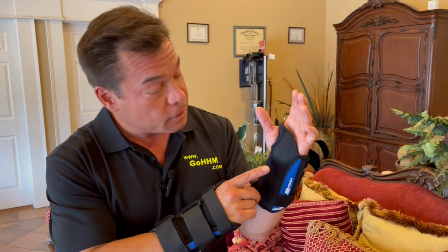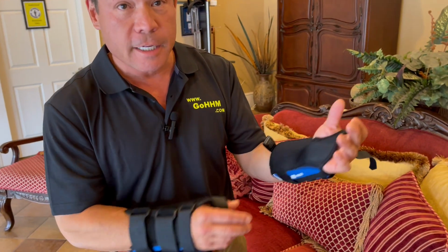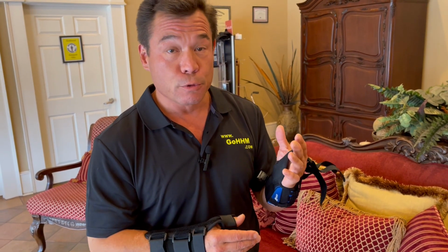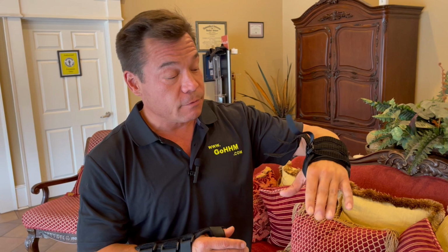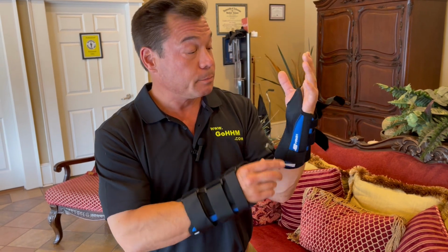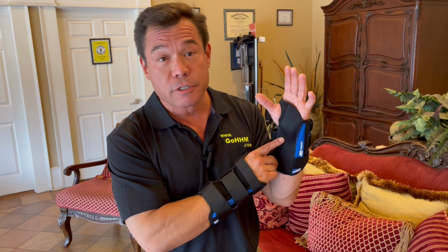Another couple of things with this, it's got the brace in here that holds your hand steady. Now these are used for carpal tunnel. And as you know, carpal tunnel affects your hands and your tendons in your arm, and they become inflamed from overuse. So this stops your hand from dropping at the wrist and keeps your tendons in the arm from acting up.